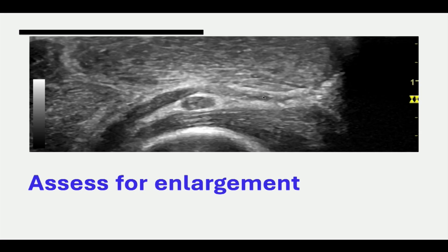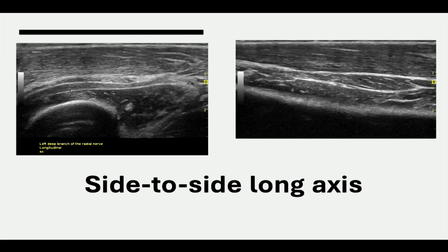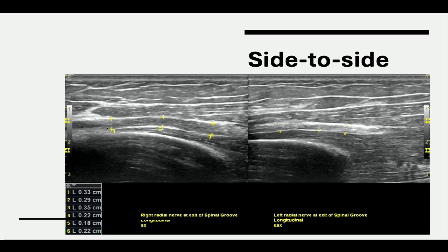When identifying areas of enlargement, sometimes we can't always tell. If we're looking at a nerve window we're not as familiar with, that's when we should incorporate side-to-side comparisons. Here's a side comparison of the deep branch of the radial nerve in long axis — if you were not familiar with its relative size, you can do a similar window on the opposite side and determine that this is significantly enlarged. Another example where the difference is a little more subtle, but you can distinguish that this radial nerve is enlarged compared to the one on the opposite side over a diffuse area.